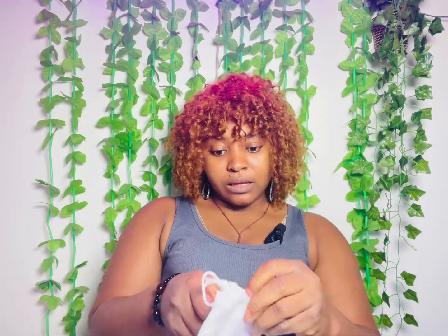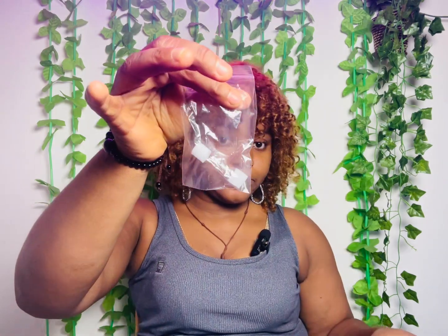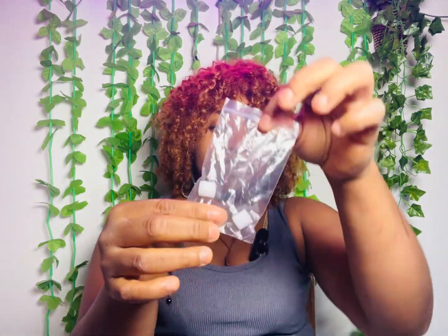And lastly, the reason why I made this video is to show you where you can change the filter, because I had difficulty, like I said, when I was searching for how to change the filter on YouTube. I couldn't see a video, so I had to make one. That being said, this is the air filter. It looks like a foam. Okay, squishy. This is it.